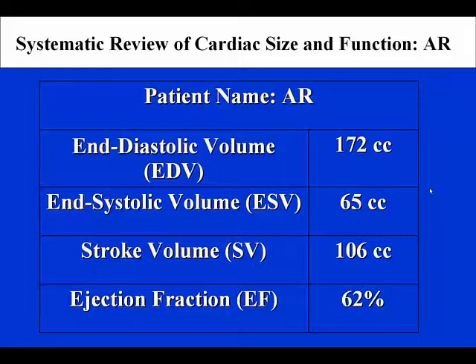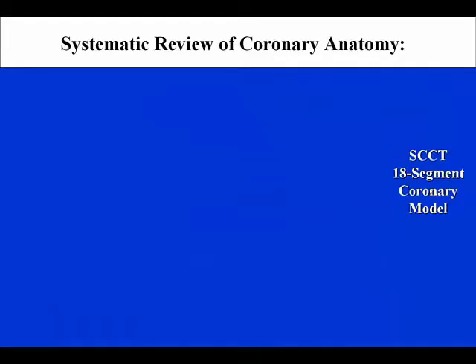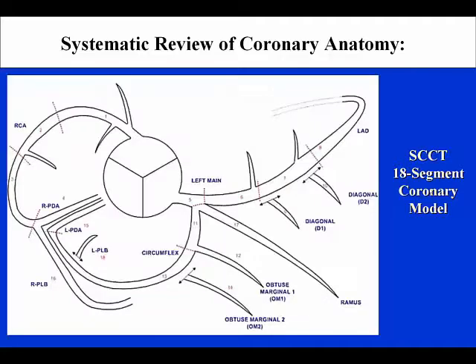For analysis of the coronary arteries, the current recommendations are to use the Society of Cardiovascular CT 18-segment coronary model, which is demonstrated here, representing the left main, proximal mid- and distal left anterior descending with first and second diagonals, evaluation of the left circumflex including the possibility of a ramus intermedius, as well as the possibility of left-sided predominance including a left posterior lateral branch and a left posterior descending branch. Also, the right coronary artery is divided into proximal mid- and distal segments, including a right-sided posterior descending and a possible right-sided posterior lateral branch.